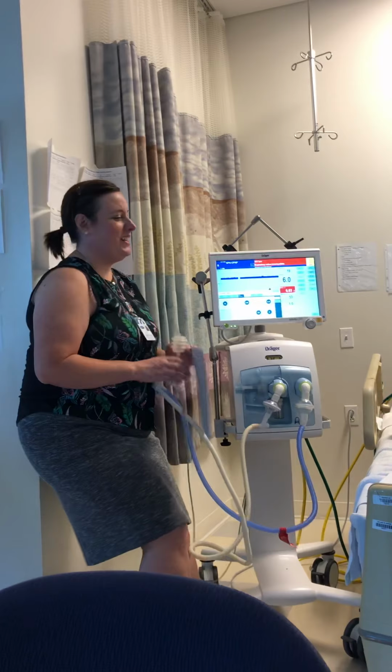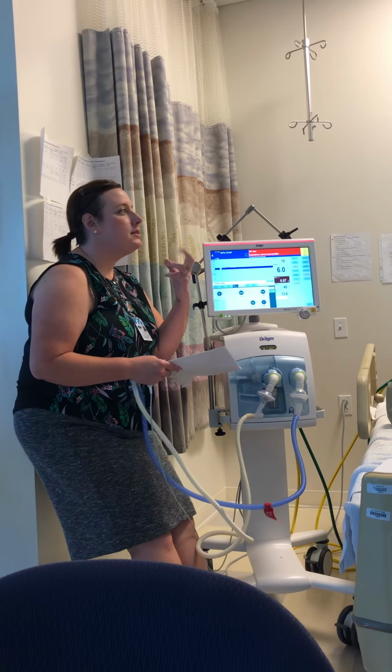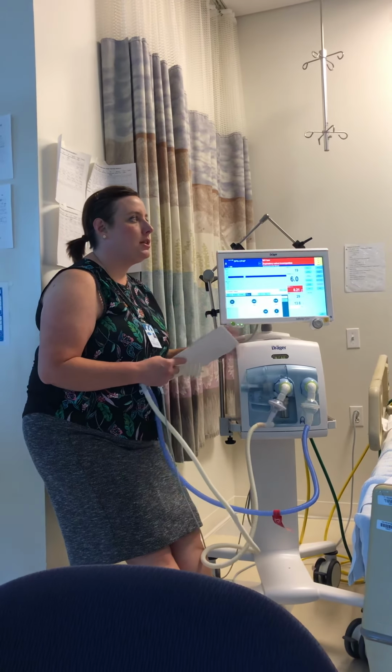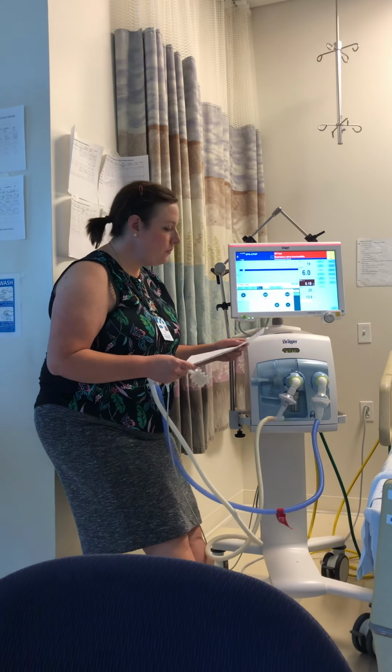Is it all okay in there? And then I also looked at the prongs, because the prongs can get very boogery, and you want to make sure that those are still patent, and I might give the patient a quick little nasal suction. Does that make sense?